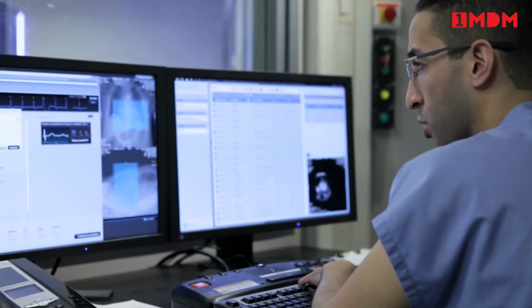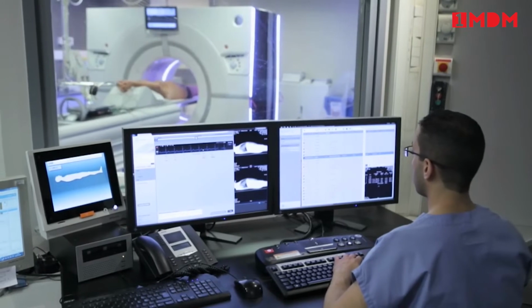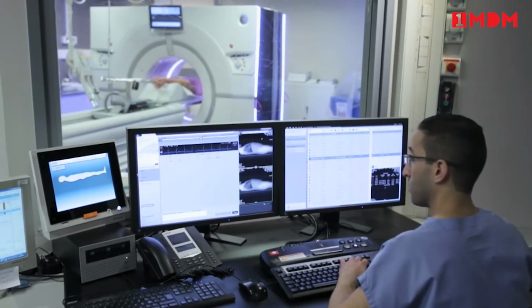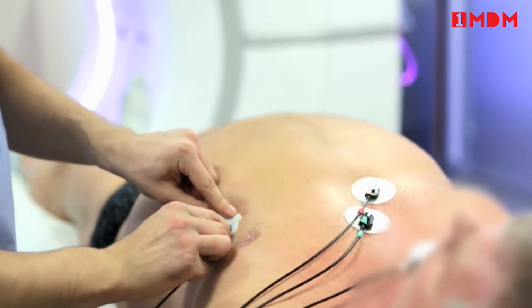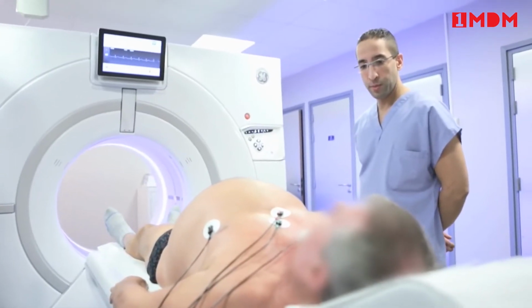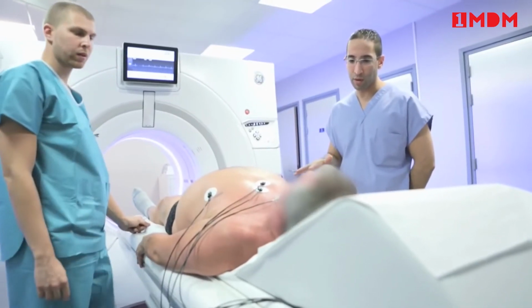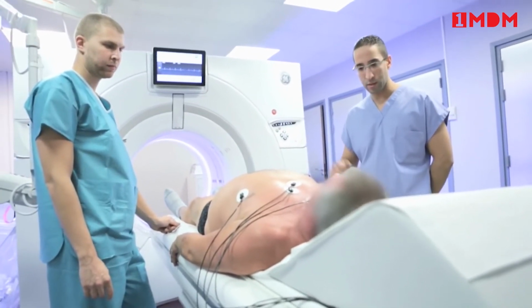The user interface of Revolution CT is very intuitive, and you quickly get used to it. After only 1 day of using the system, we were already scanning 40 patients in a 9-hour day. Patient preparation is easier thanks to the large bore and the integrated ECG. And the low noise level of the system improves the communication with the patient during the exam. Besides, less effort is required for the patient thanks to the speed of the system.